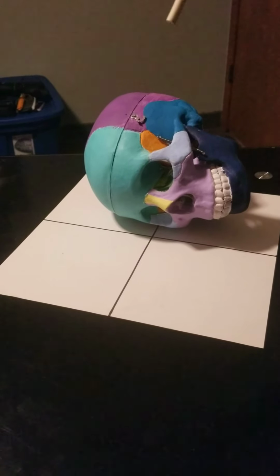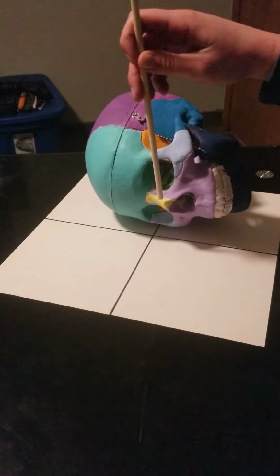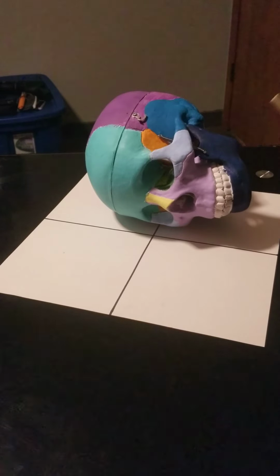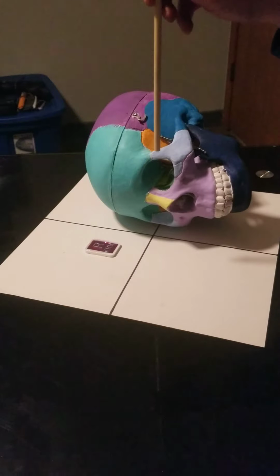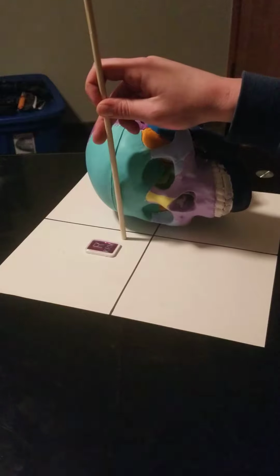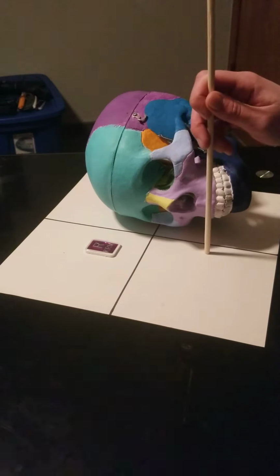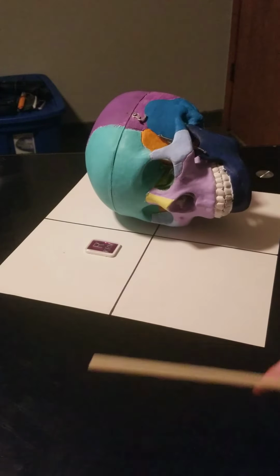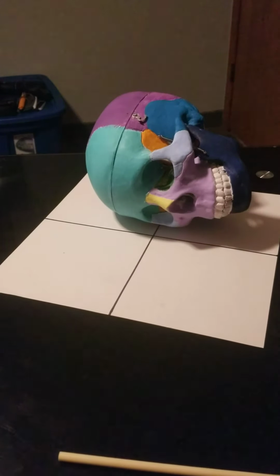And I'd want my CR to enter perpendicularly to a point a ½ inch distal to the nasion, so about there. I would place my marker. I'd want my collimation to be from the glabella down to 1 inch inferior to the acanthion and a ½ inch beyond the tip of the nose. And I would instruct my patient to stop breathing and take exposure and let them know that they can breathe.